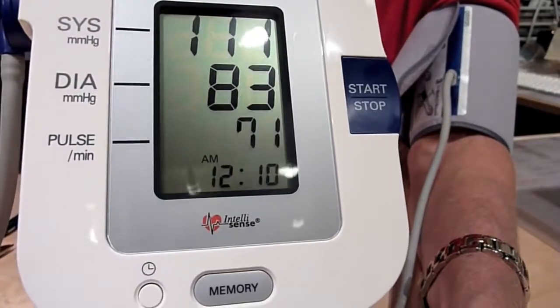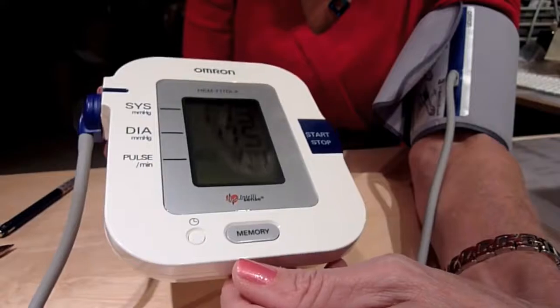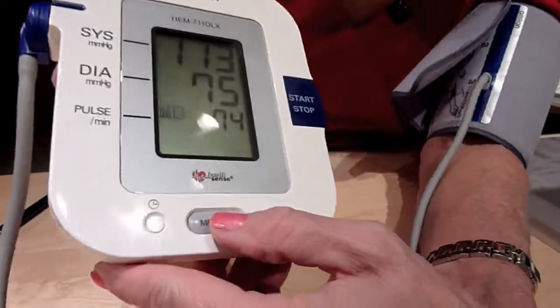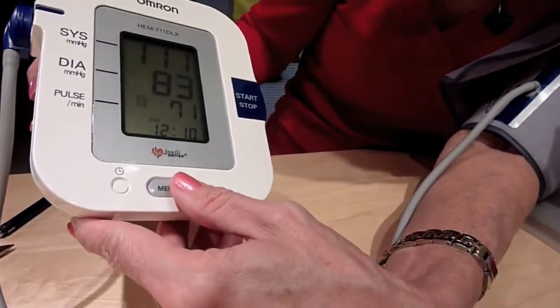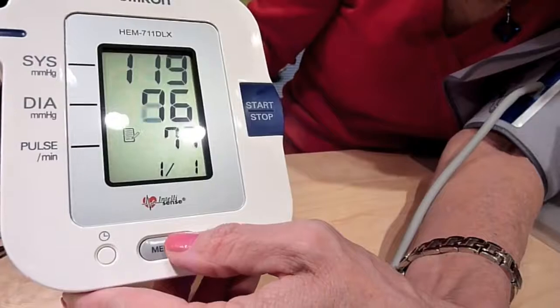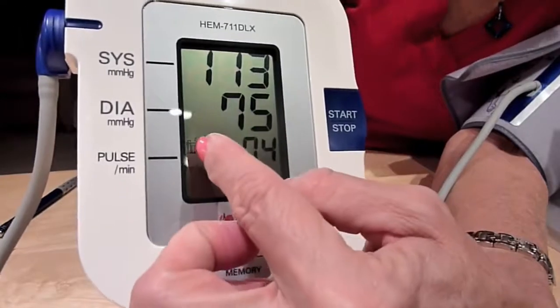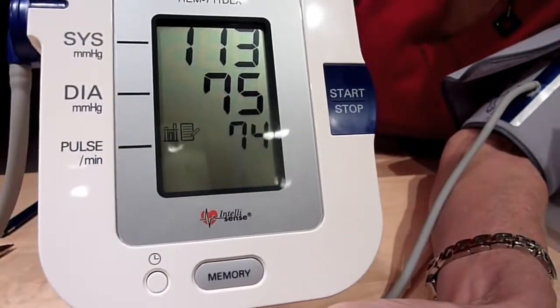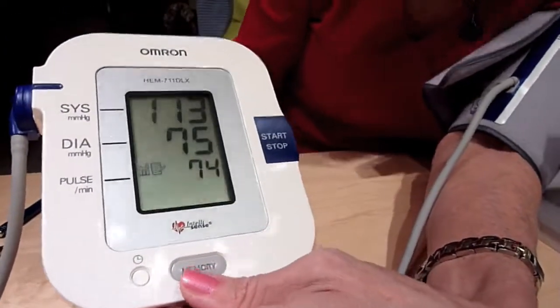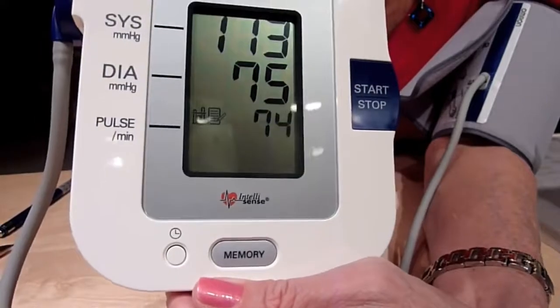Once it's finished your reading, if you want to keep it, touch the memory button and that saves it. You can hit it again to scroll through previous readings stored in memory. There's also a symbol that tells you it's taking all of your stored blood pressures and giving you an average of your blood pressure and pulse — a handy tool, because sometimes you'll have the odd high or low reading that isn't reflective of what you typically are.